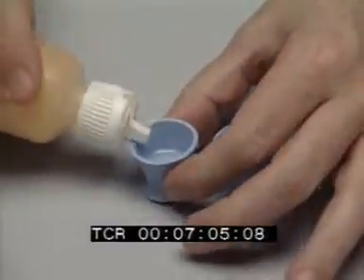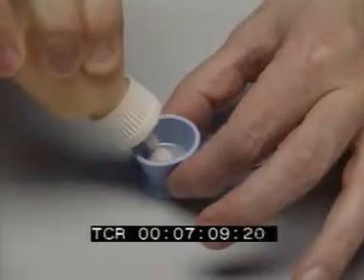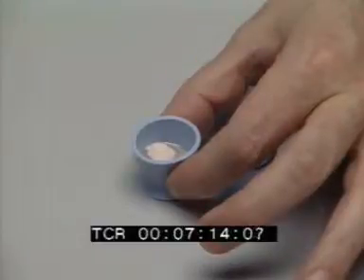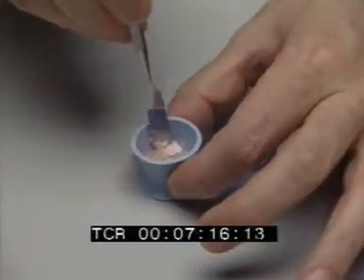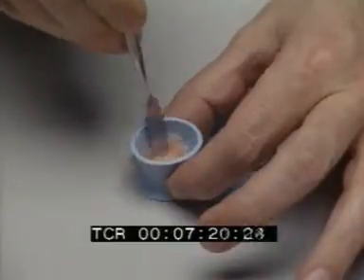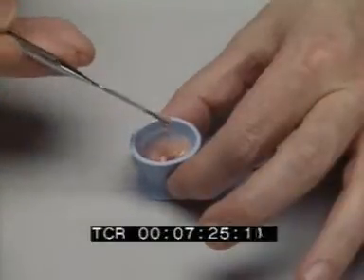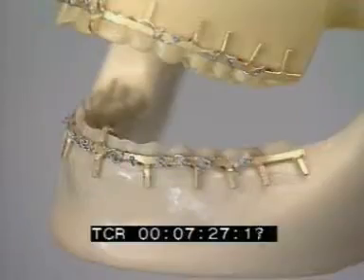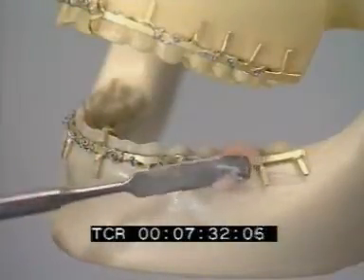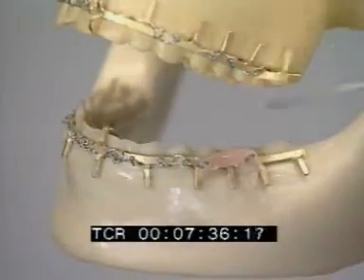Polymer is added to one of these containers so that it's moistened by the monomer. A spatula is used to mix the two until they become a paste. This methacrylate is applied as a uniform thin layer around the entire arch bar.